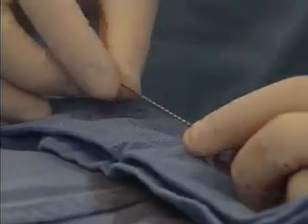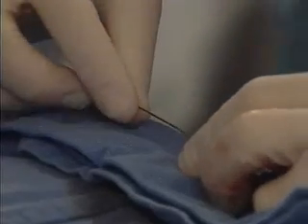And we're going to go on to fluoro. So we call this a guide wire, the wire that you see that the stent is tracking over, and that's a pretty good name for it because it helps to exactly guide the stent inside the correct path into the blocked artery and into the blockage. And so now we see the live fluoro image. The wire is downstream. That dark snake-like thing you see down there is the end of the guide wire inside the right coronary artery. And then we'll see the stent coming out of the guiding catheter probably momentarily.